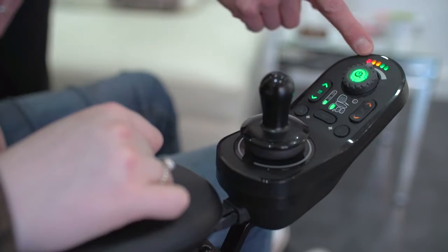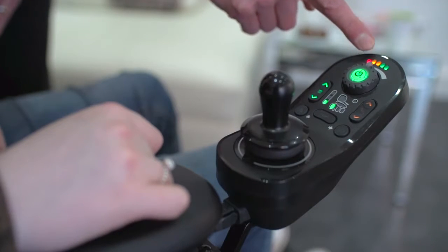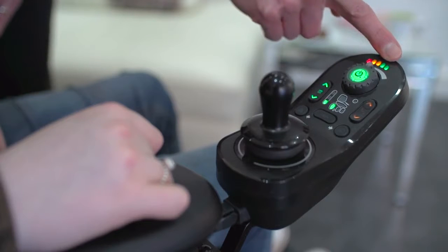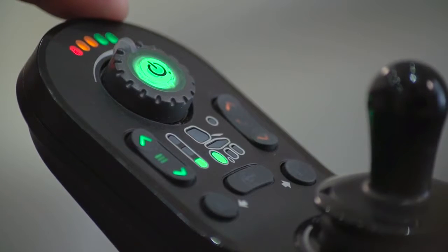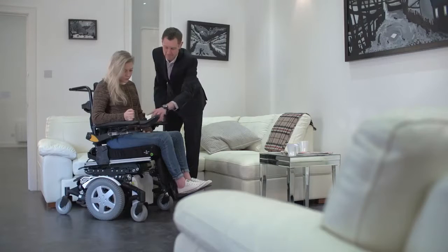The battery gauge is located at the top of the remote and is visible when driving. Each of the five LEDs represents 20% battery life. Five lit LEDs means the power chair is fully charged.